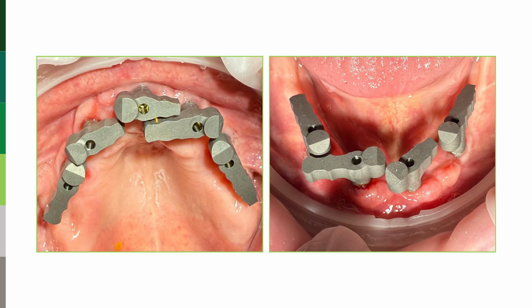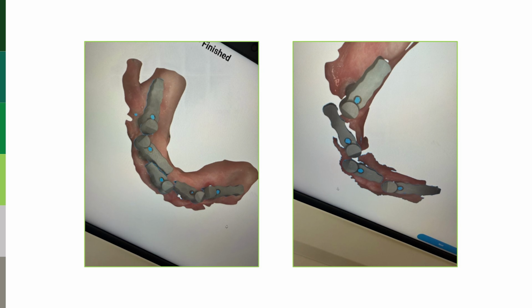We have done the scans of his vertical or his bite, with the 2 bridges in situ. We've removed the bridges. We've done the 360 of each bridge with the ArchBridge reverse scan body screwed into the temporary cylinders. We have then added the ArchBridge scan bodies to each of the MUAs and scanned that in the mouth, and then finished up with a soft tissue scan and photographs.